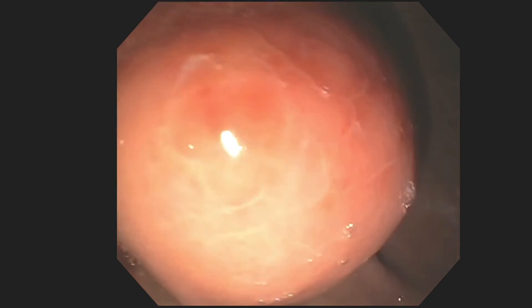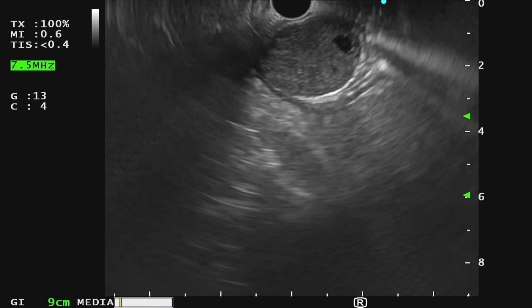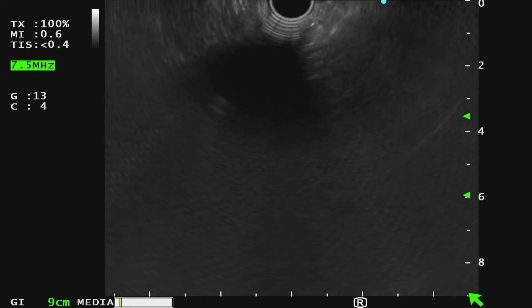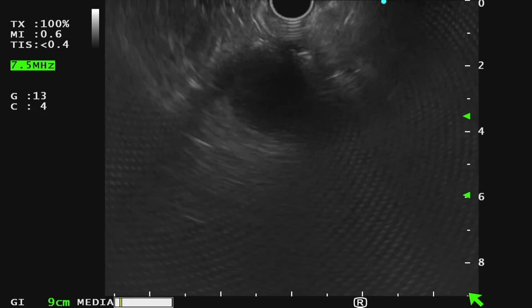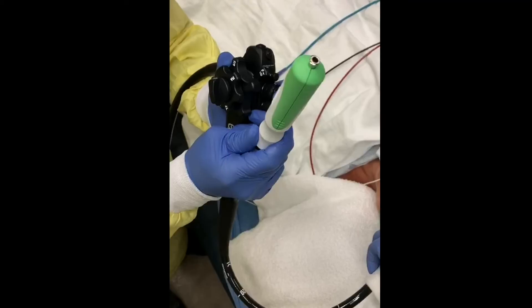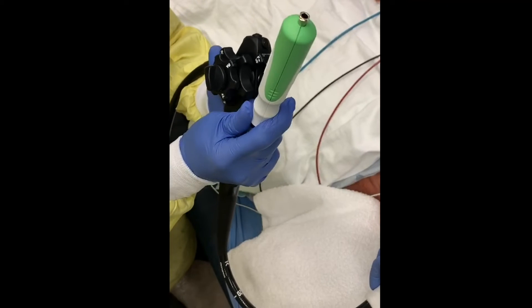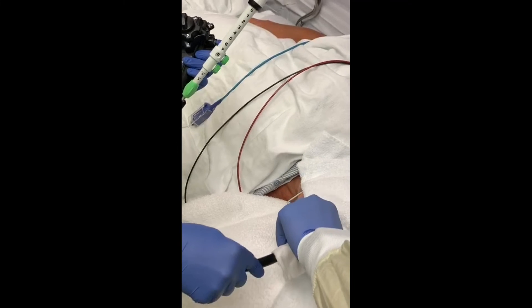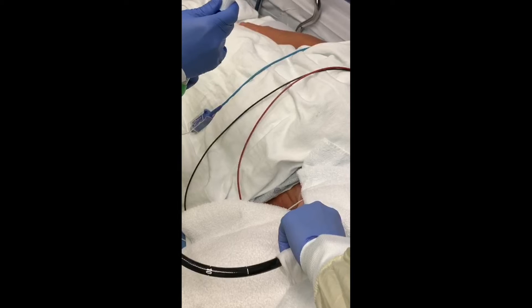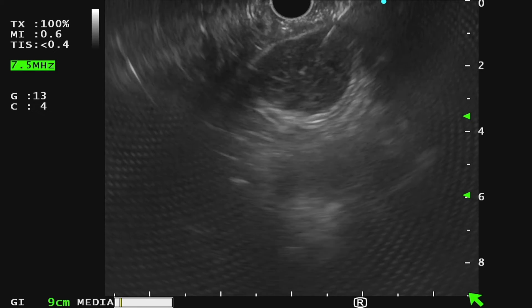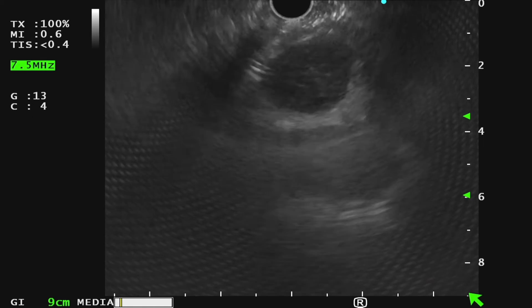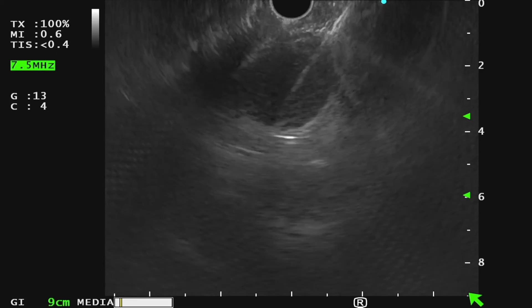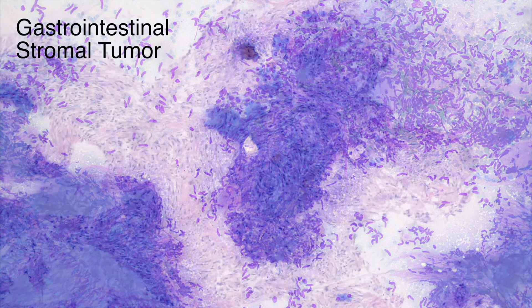This patient presented with a 25-millimetre gastric submucosal lesion. These lesions are mobile and can be very challenging to sample as the needle bounces off at each puncture attempt. Positioning the echoendoscope as close as possible, applying suction and complete tip-up of the big wheel will enable one to kiss the lesion with the echoendoscope. The technician can help by bracing the echoendoscope shaft as it exits the mouth to prevent the needle recoil effect. These manoeuvres should help with successful needle puncture. Once punctured, the needle should be fanned and anechoic areas should be avoided so that necrotic material is not aspirated. The final diagnosis was a GIST as suspected.